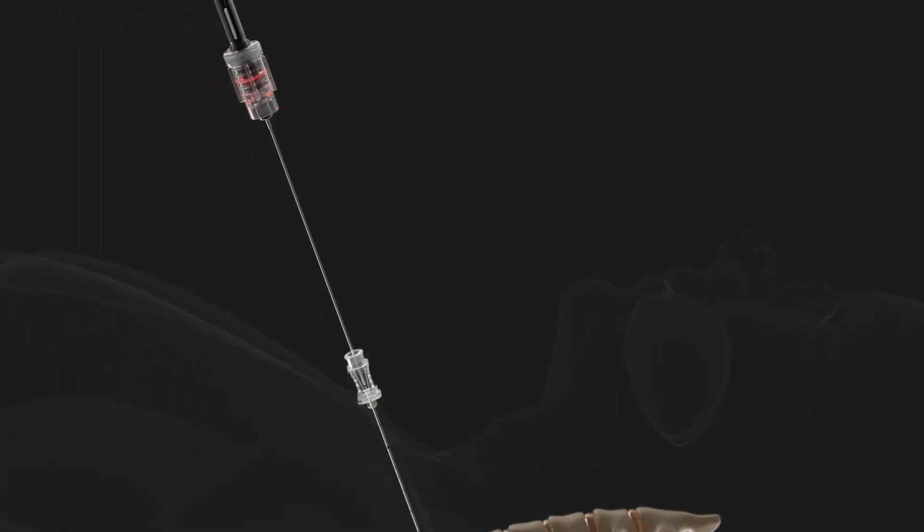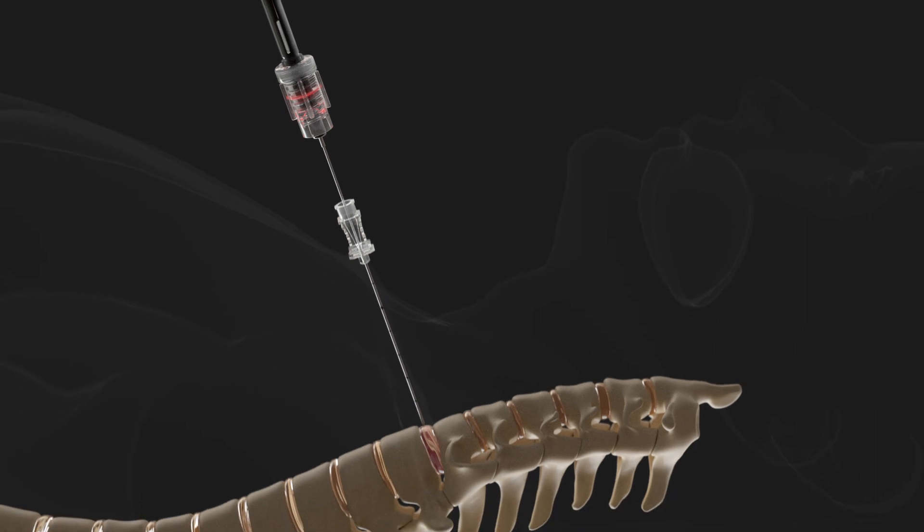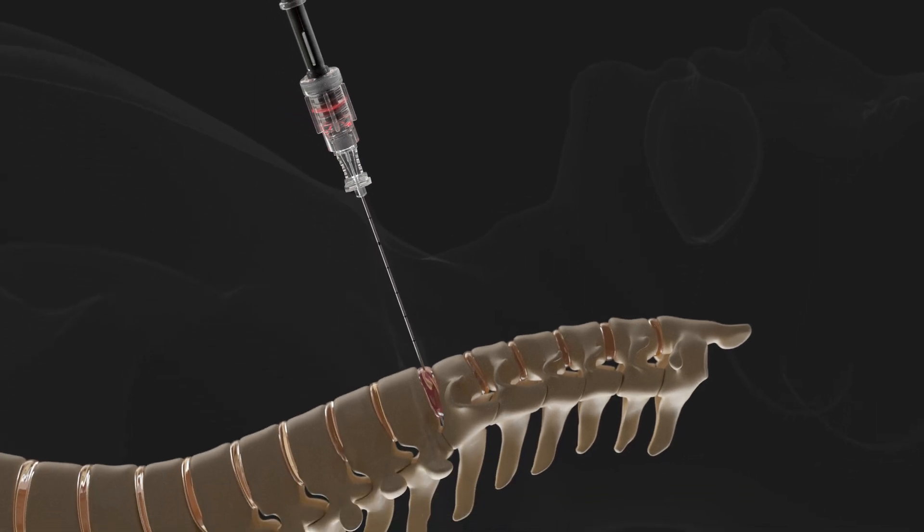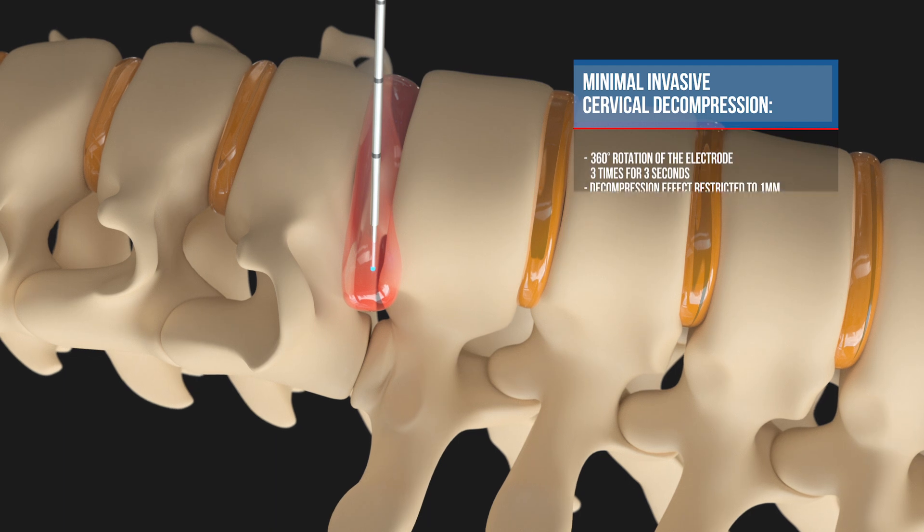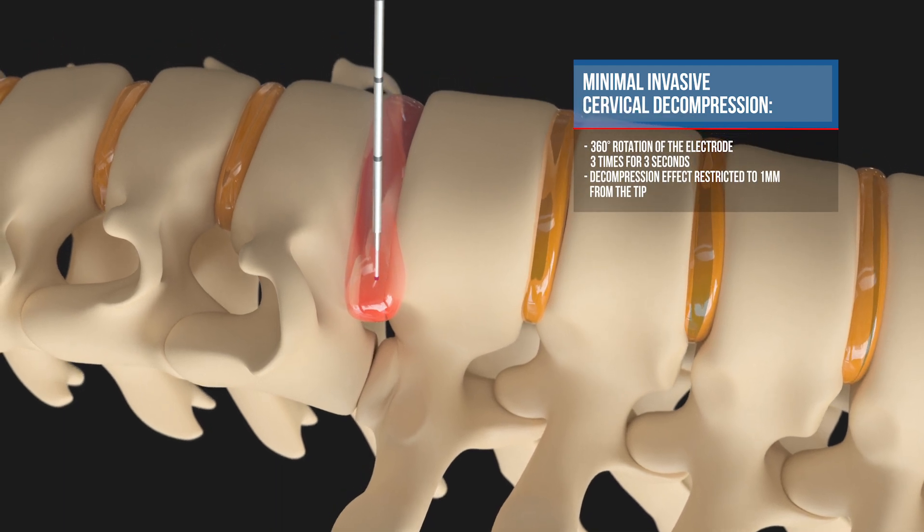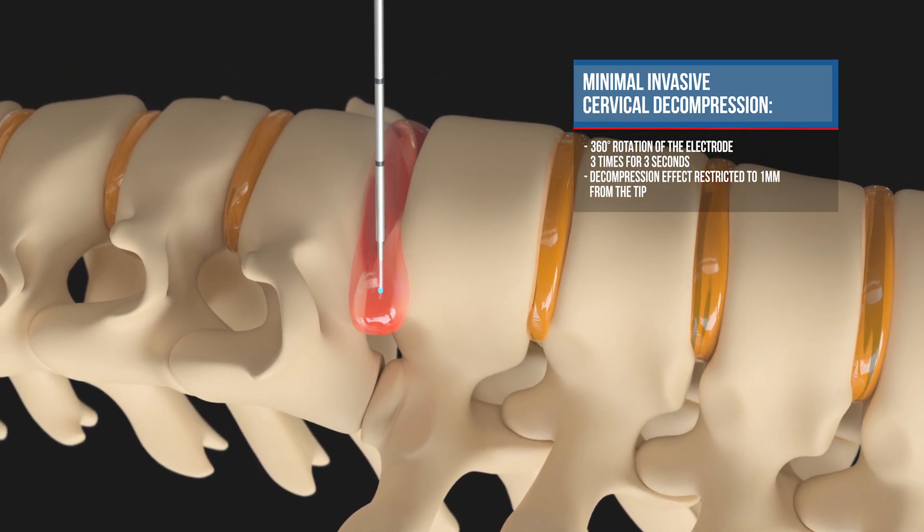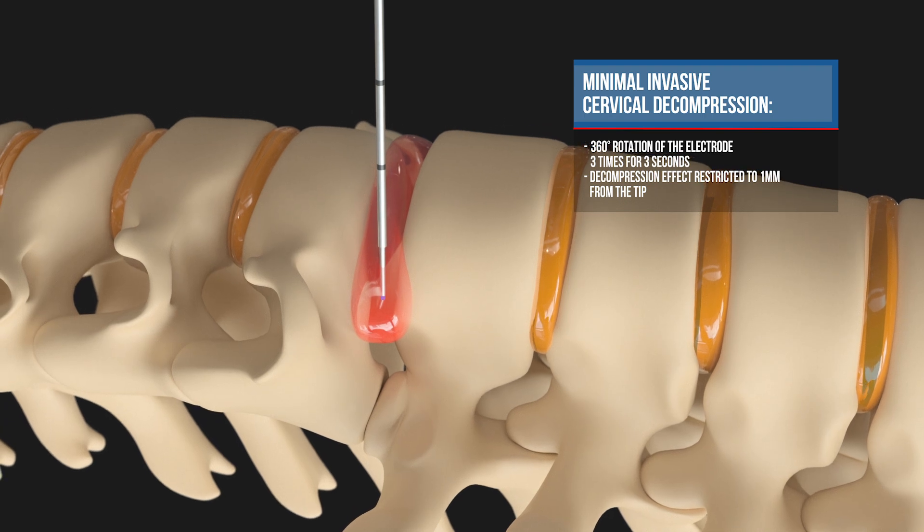Confirm proper placement using fluoroscopic guidance. Remove stylet, insert Residisc into needle and secure devices using Luer lock connectors. Connect the Residisc with the Resoblator Smart and perform decompression through quantum molecular resonance by activating the generator three times for three seconds, rotating the electrode 360 degrees.